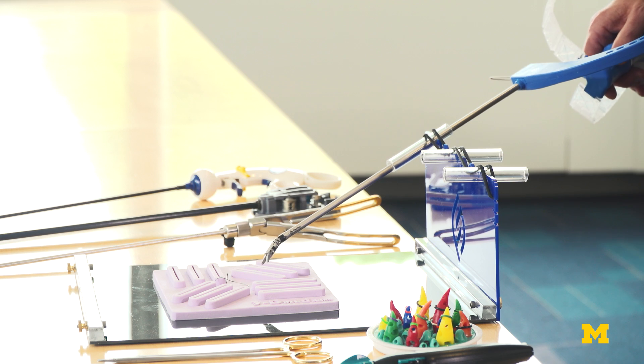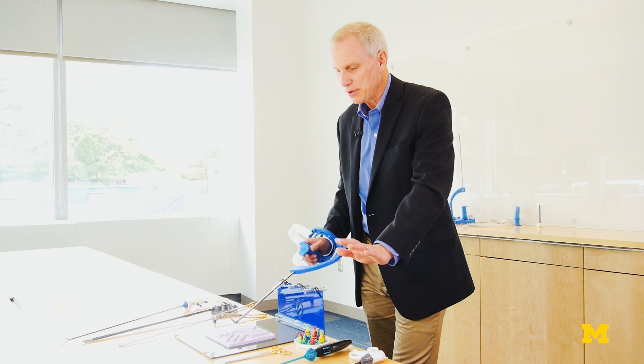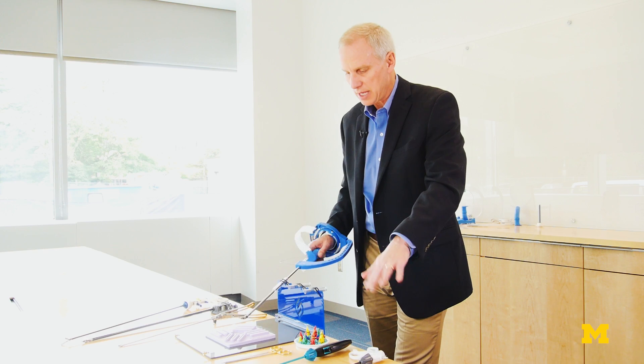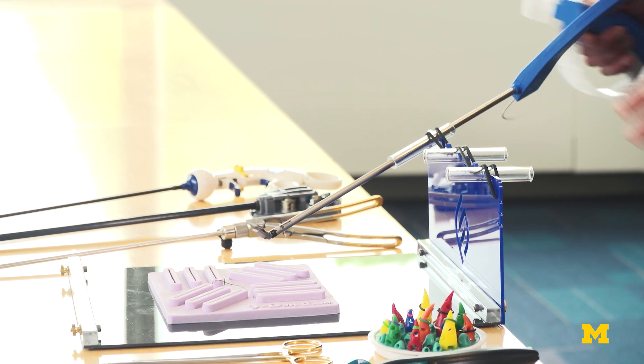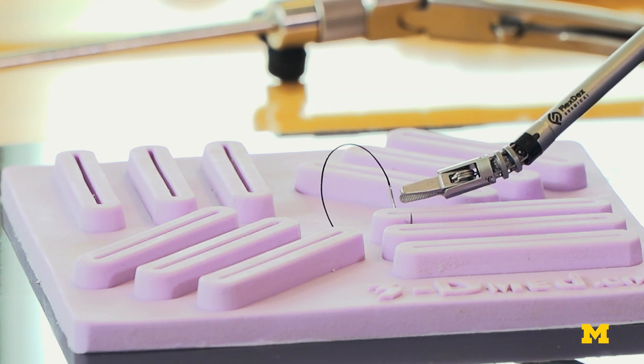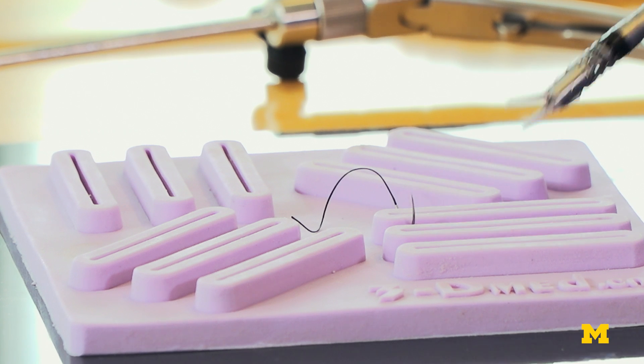If I move my hand up, the device goes up. I'm demonstrating it using my other hand just to show you how natural it is. If I move left, right, up, down — wherever I move my hand, the tip of this instrument moves. I'm coming into the tissue perpendicular the way we want to, and I'm following the curve of the needle.